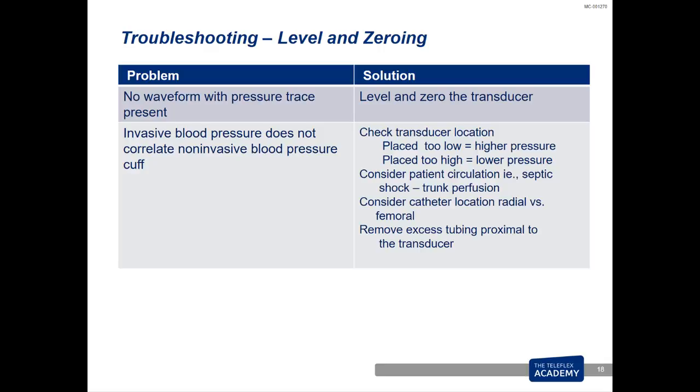If you have no waveform present and you have a pressure trace on the monitor, you must assume that the pressure transducer has been connected. It's connected to a cable, therefore reflecting a trace, but because it hasn't been zeroed yet, there is no waveform showing or demonstrating on the monitor.